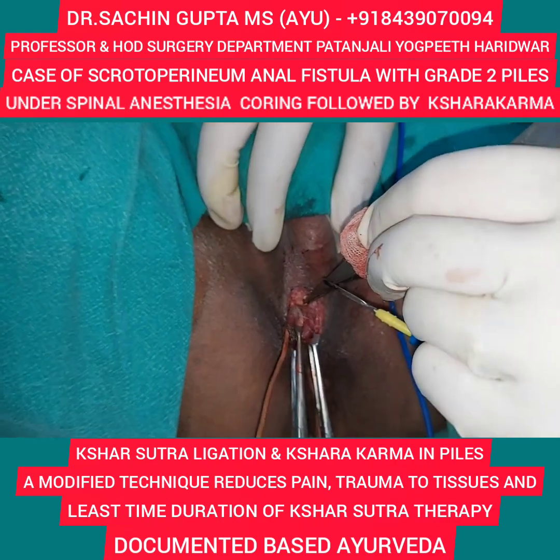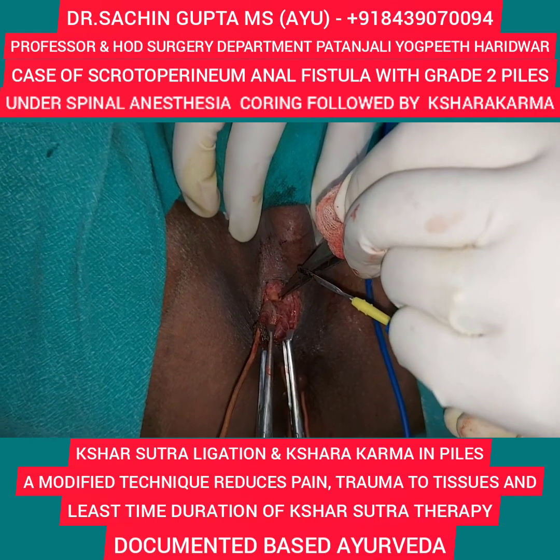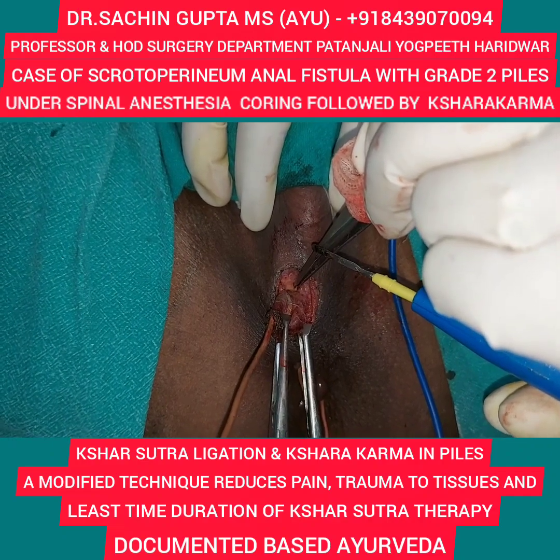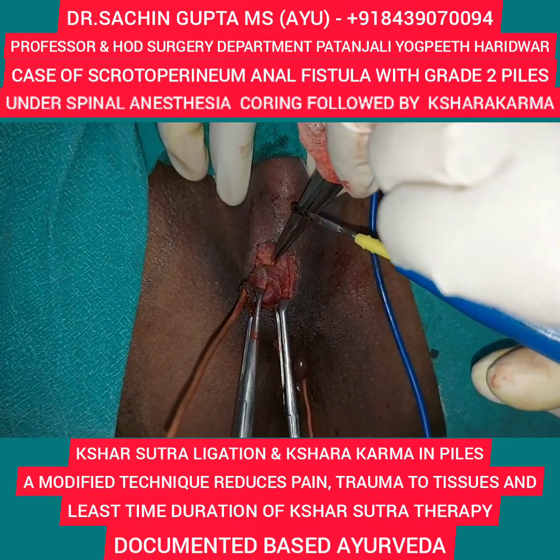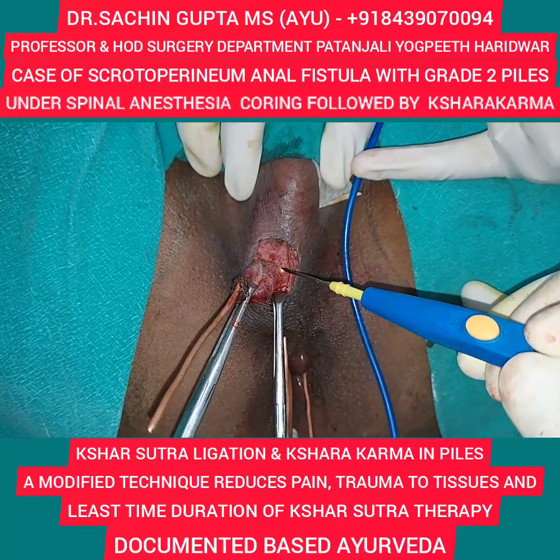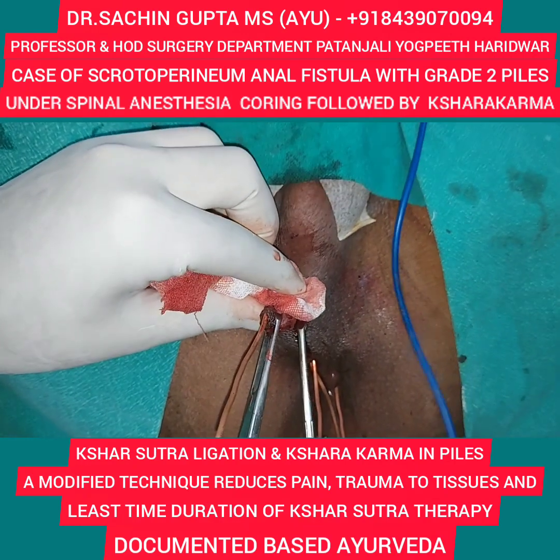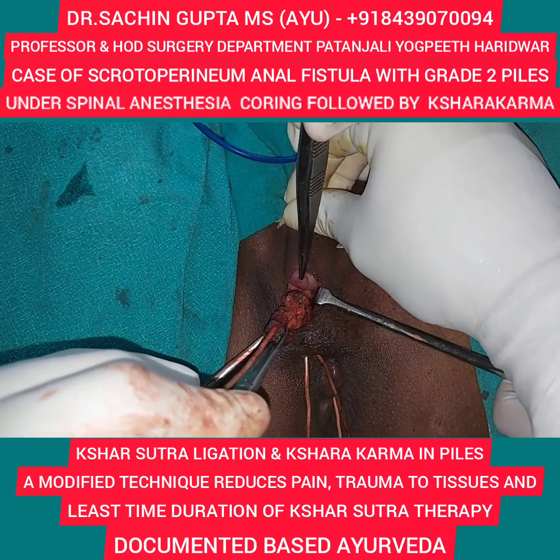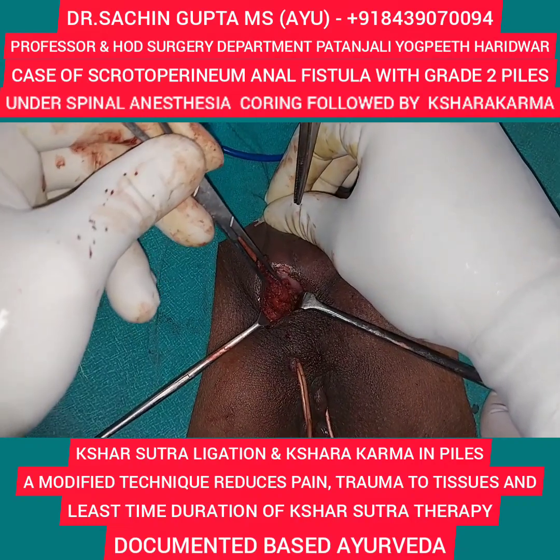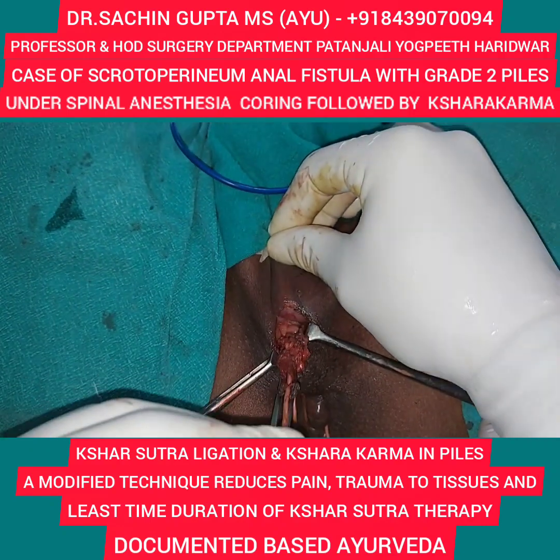So tract is taken out from the base of the scrotum. Do not explore this scrotal sac if it is at the base of scrotum. This is scrotal sac, you can see. Here is the scrotal sac and this tract is attached here. First the attachment is released from the scrotal sac behind, then I'll start the section around the tract.